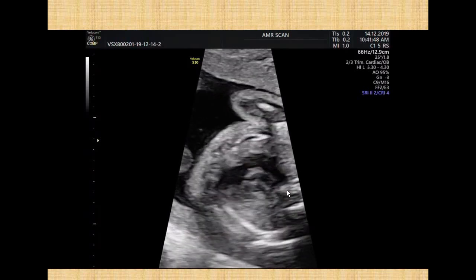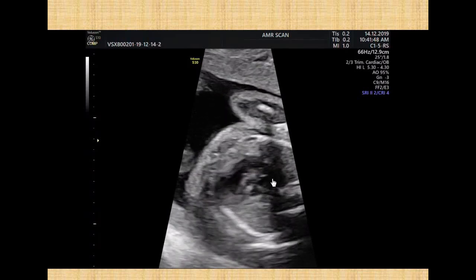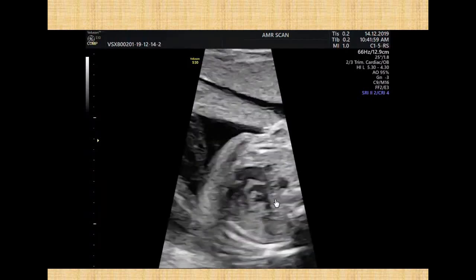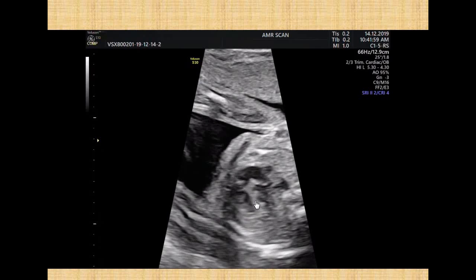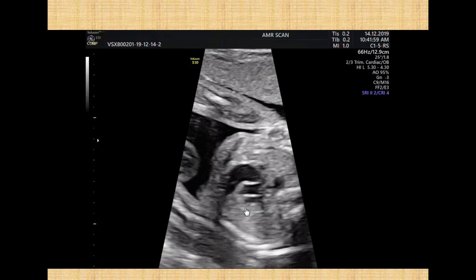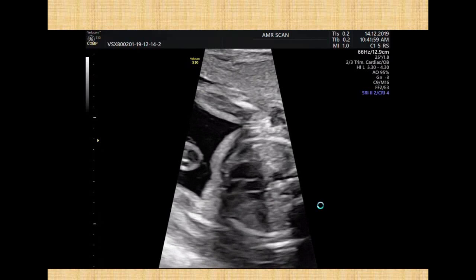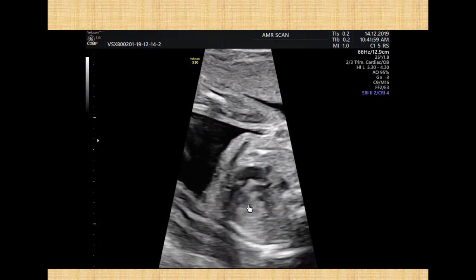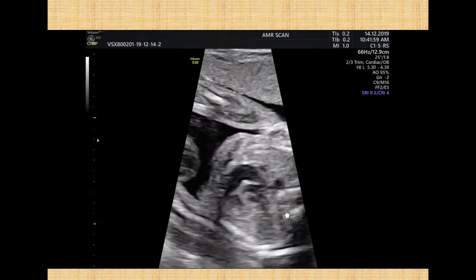The clip here stresses the double outlet right ventricle with two parallel outflow tracts. Another clip showing the same finding. And if you focus on this clip, you will notice that the smaller artery is partially committed to the ventricular septal defect right here. Again the same findings, with the smaller pulmonary artery partially committed to the ventricular septal defect.